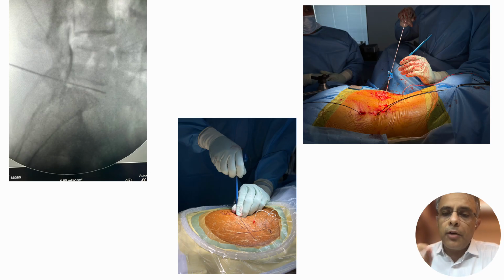You start with 0.5 milliampere of current, and then you can go to 1, 1.5 and 2. I go up to 3, but it is said that up to 2, if you get to the safety, then your ENR is far away from where you are putting your cage on the annulus. So that makes your surgery safer.